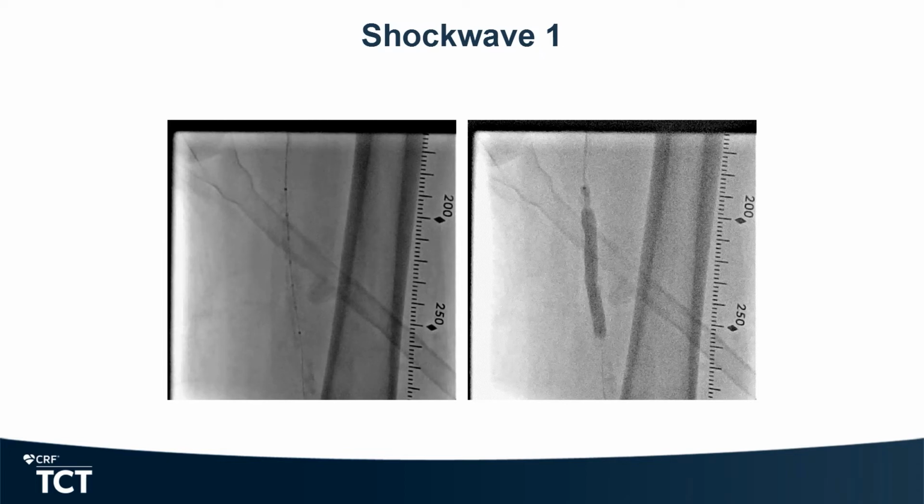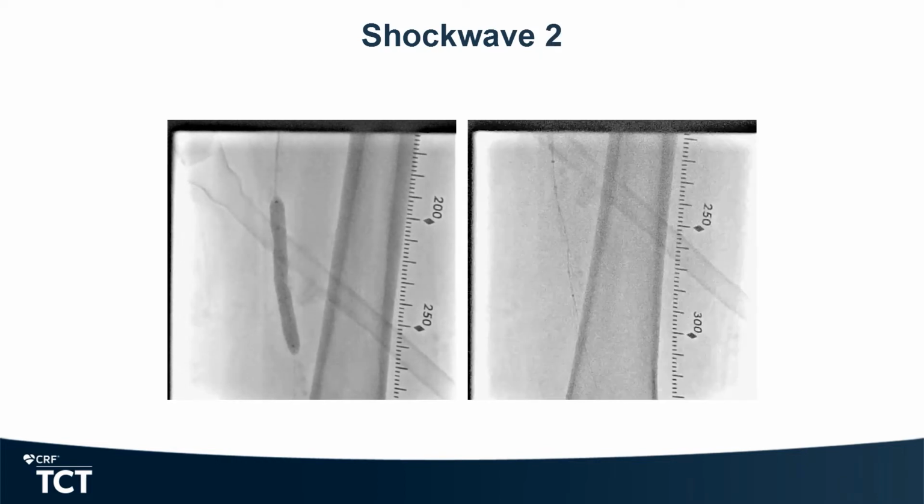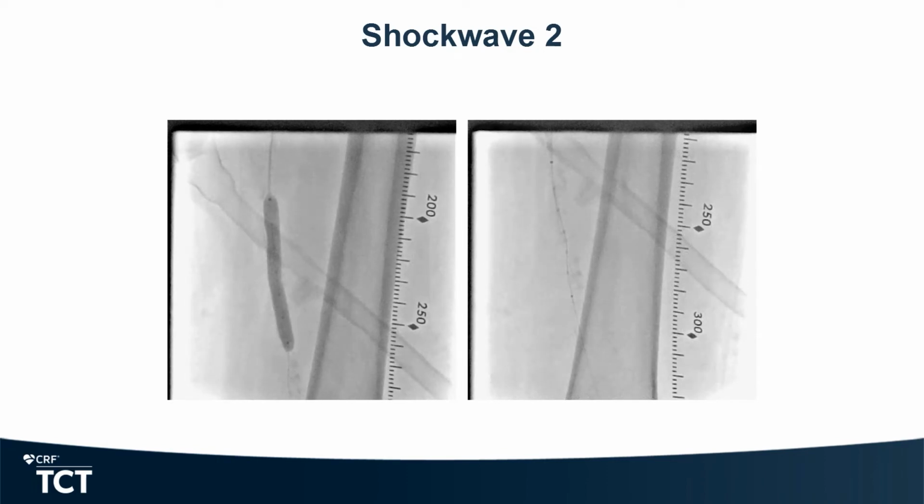So the patient, as you can see, got an M5 catheter. This is, I think, a 6 by 60. And you can see we did serial dilatations, and we've learned over time that even in the subintimal space, you can do proper one-to-one dilatation with a Shockwave IVL catheter.